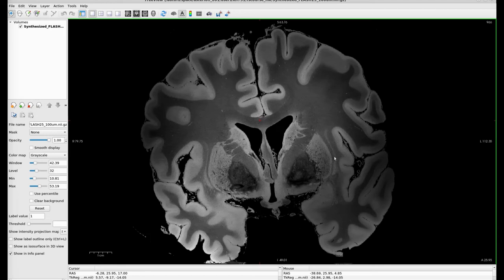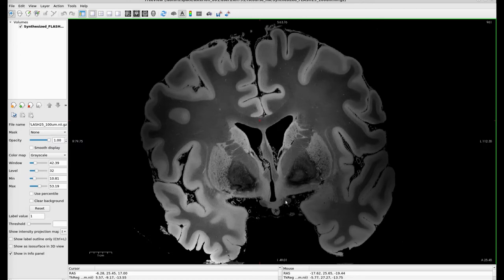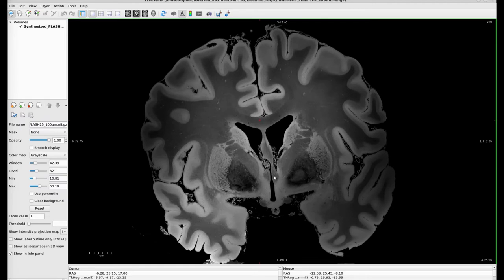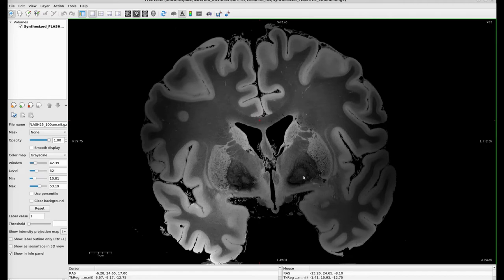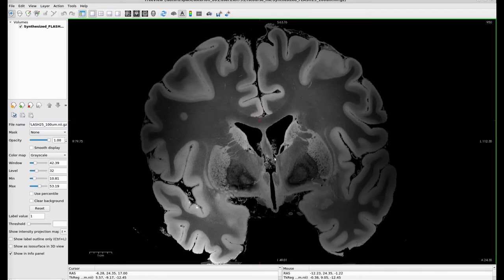Now we're seeing some claustrum right here — these tiny wisps right here. And we're now seeing the optic tract. The fornix, another commissure, has come into view. We talked about the globus pallidus earlier — now we can differentiate between the globus pallidus externa, which is the structure right here, and the globus pallidus interna. We're also starting to see the hypothalamus right here, and we're starting to see the choroid plexus, which is found within the lateral ventricles of the brain.